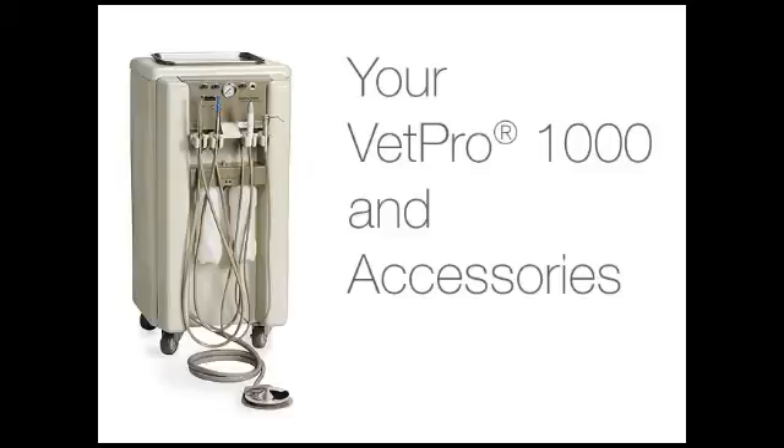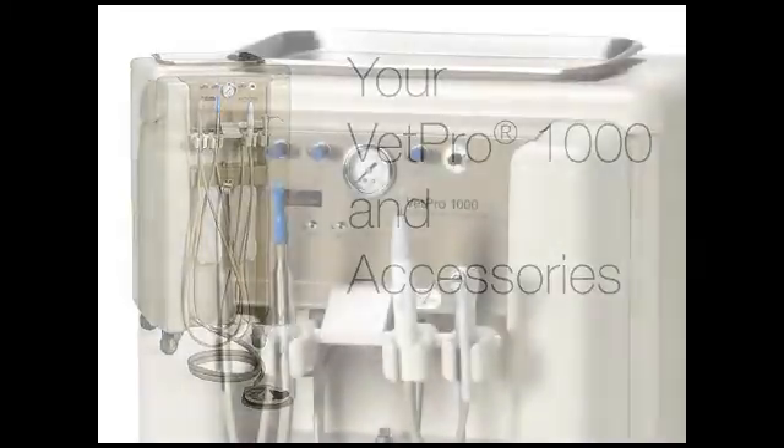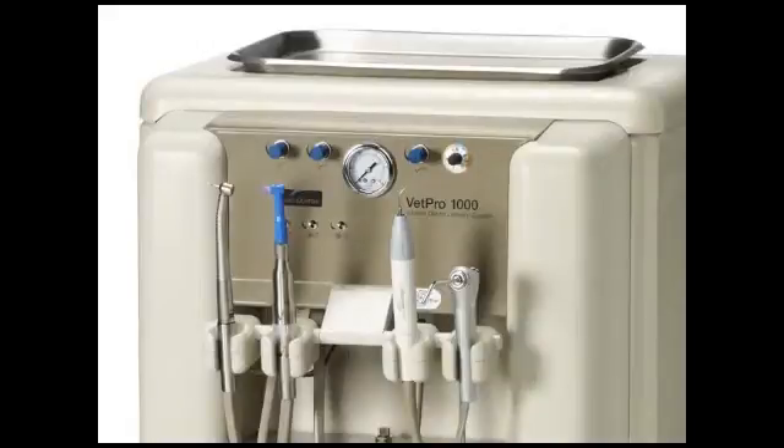Your VetPro 1000 and accessories. When you receive your VetPro 1000, it will include an assortment of equipment and accessories. It is essential to know the different components that come with your VetPro 1000.